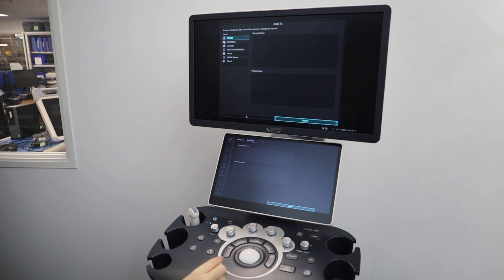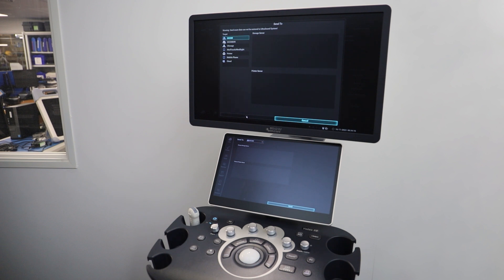Remember to export your report at this point if you have one. These systems can also be set up to PACS as DICOM files.